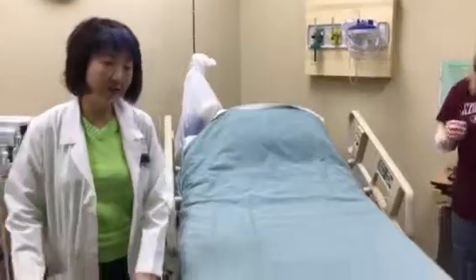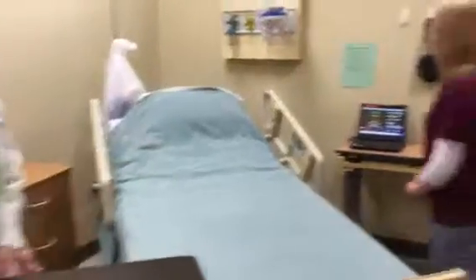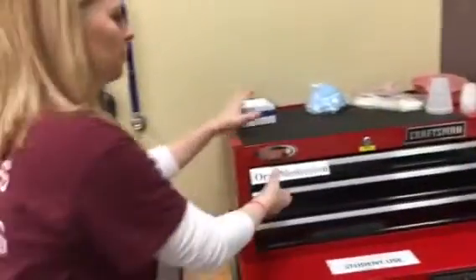Okay, and the patient has the bedside table. We would like you to use it for putting your medication and your equipment here, not on top of the patient. Correct. So let's go into the details of our cart. So Lisa, can you show them your medication?